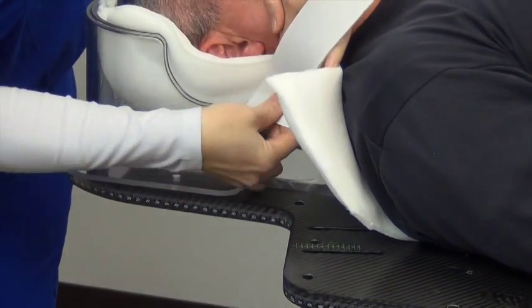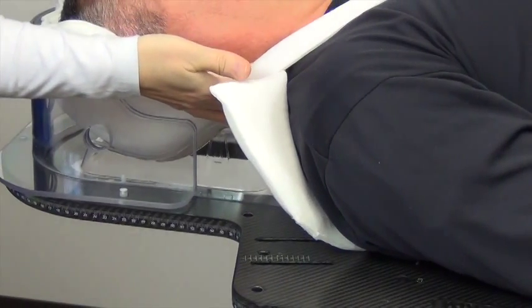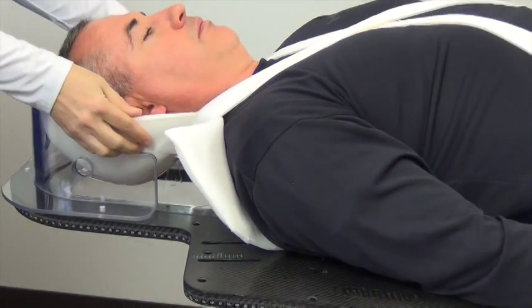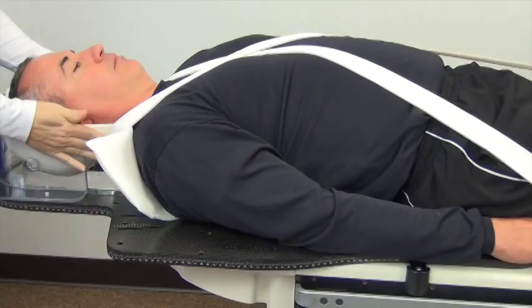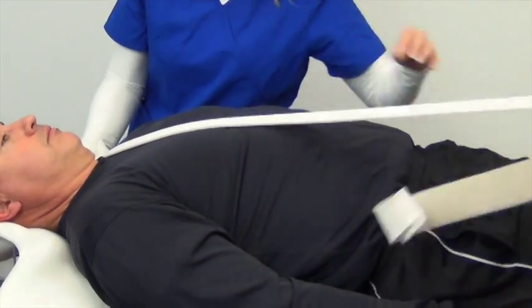Take the two inch neck strap and bring one end to the underside of the cushion, right below the patient's ear, and simply attach the strap to the cushion with the Velcro tab. Stretch the other end around the patient's torso, pull tight, and attach it to the Velcro strip on the treatment couch.